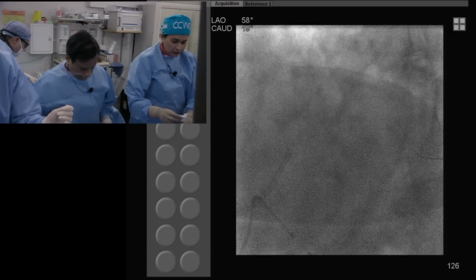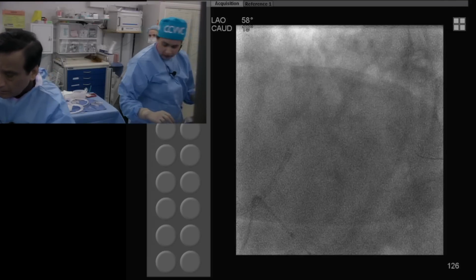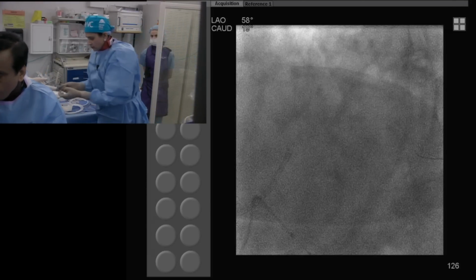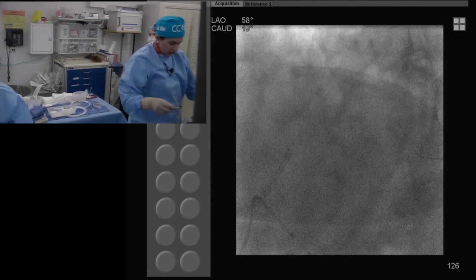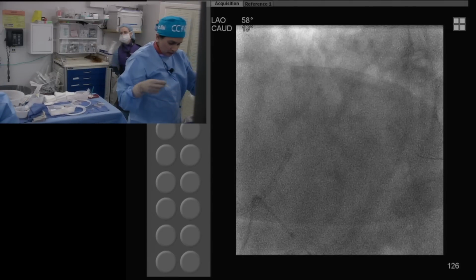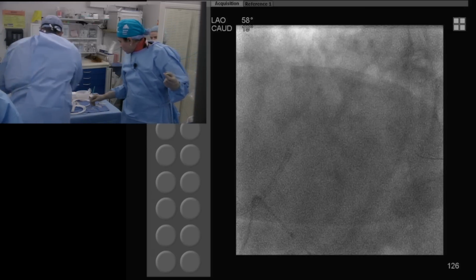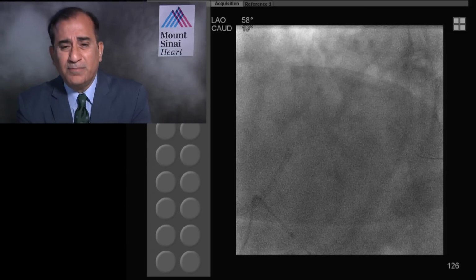Samin, very nice cover of an excellent topic, very relevant, about the role of FFR in CABG. It's contaminated now. You're touching it everywhere. Remove this. You have to change it to new. Take that away and change the personal glove. Actually, this was a totally different field. Nobody talks about this FFR.